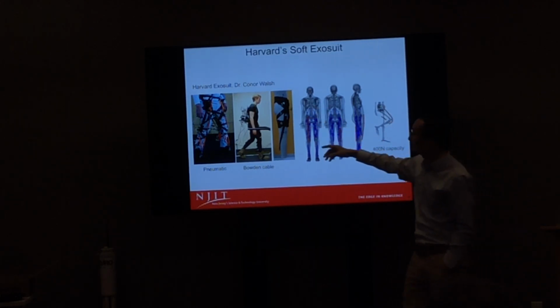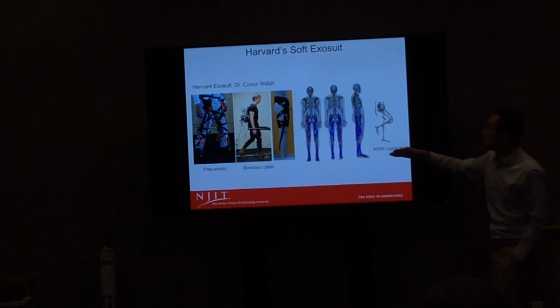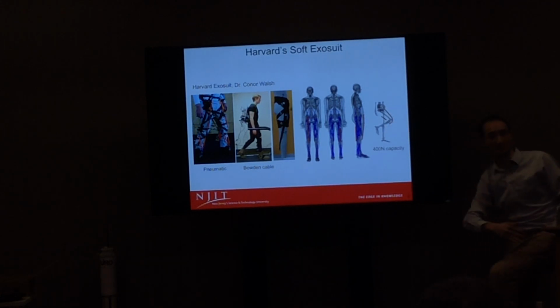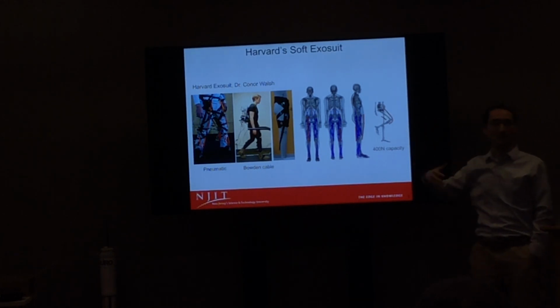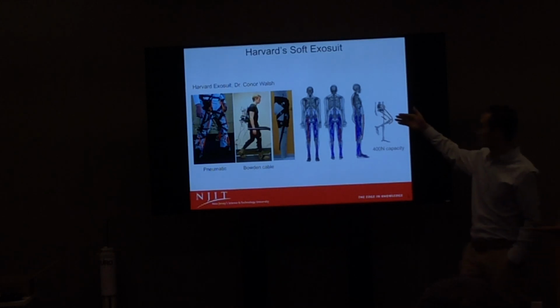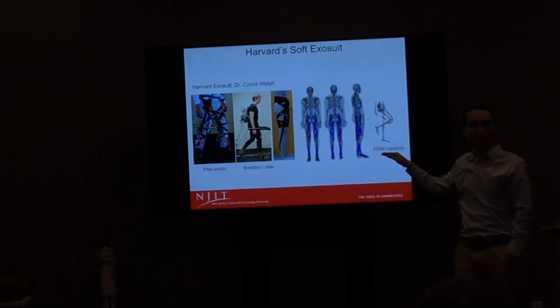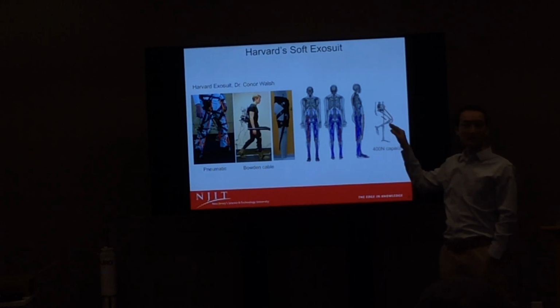So you model a few major actuators, and you make sure that when you walk or run, they actually wrap around your body. The way it models really nicely is like an additional muscle in addition to your natural one. The only thing about this kind of pneumatic muscle is it has a certain capacity of 400 Newtons, but you never worry about fatigue of the muscle. You want to utilize this muscle as much as you can instead of your natural one.